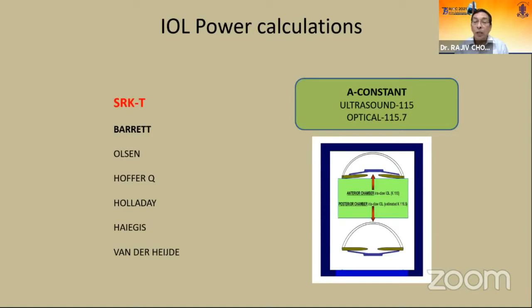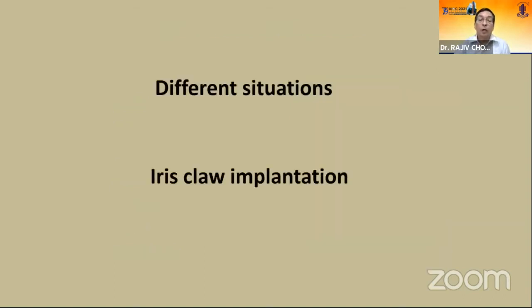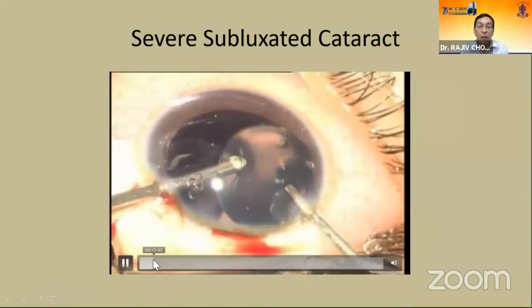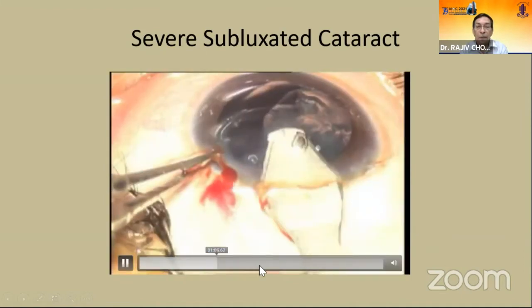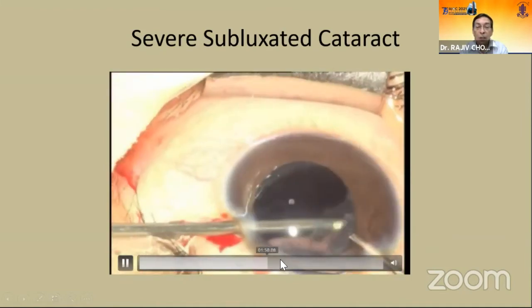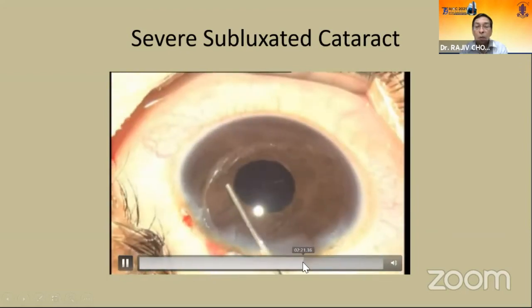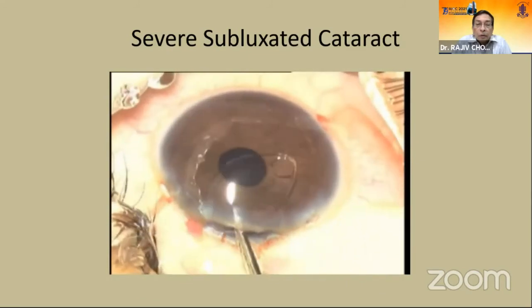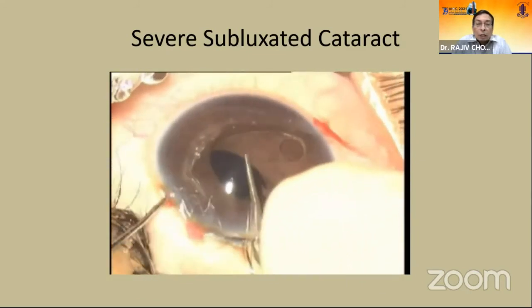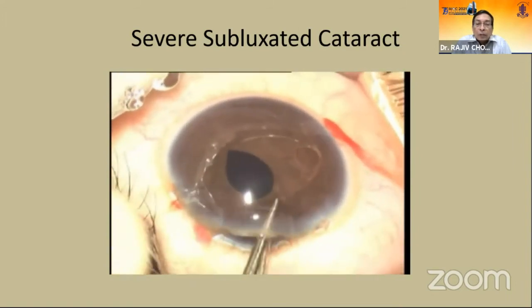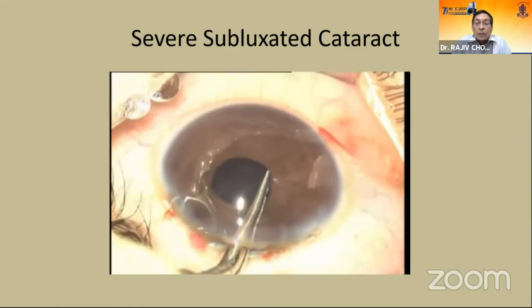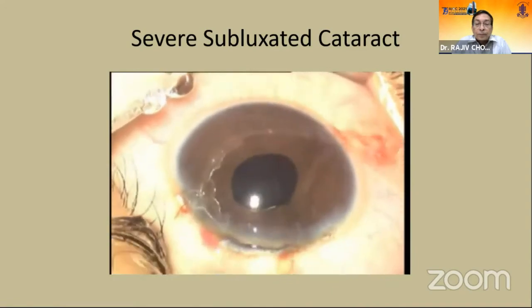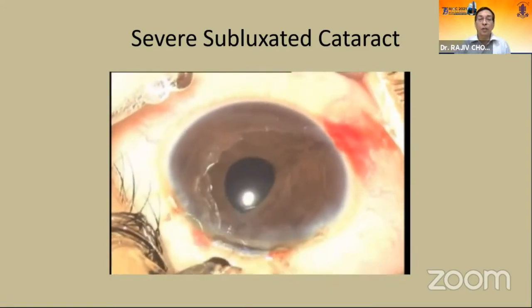In a case of severe subluxated cataract with no option but scleral fixation or glued IOL: after completing the lensectomy, instill pilocarpine — the pupil is round. Place the lens horizontally through the side port and hold firmly from that side for enclavation. The process is extremely simple — it takes fractions of a second to enclave the lens in place. Iridectomy can be done as wished. In a case of dislocated nucleus, once managed with phaco fragmentation, it is equally simple to place the iris claw lens.